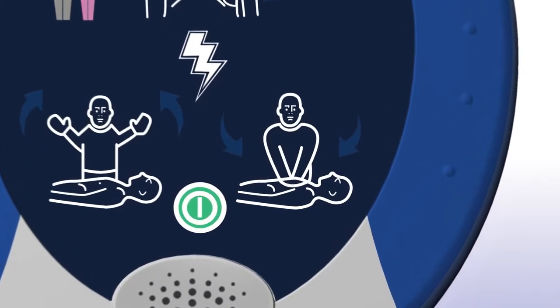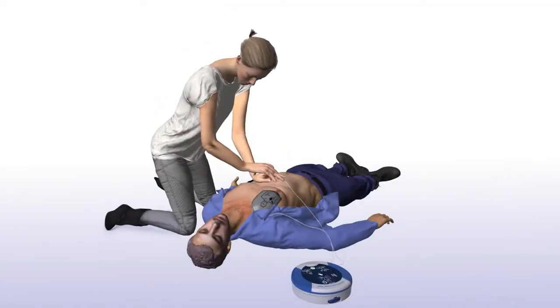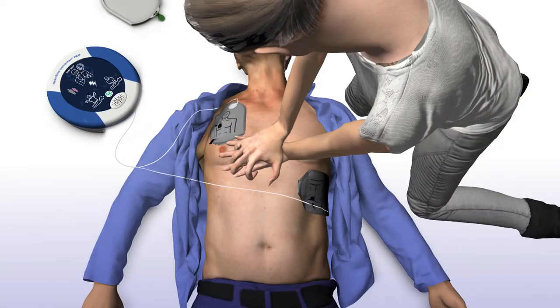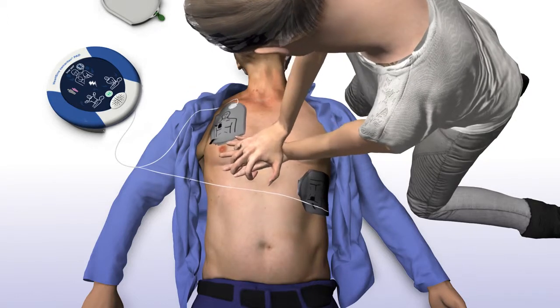The SAM 360p will prompt you to begin CPR and will continue to do so until you begin chest compressions. Begin CPR. It is safe to touch the patient. The SAM 360p will tell you how and where to place your hands. Place overlapping hands in middle of chest. Press directly down on the chest in time with metronome.